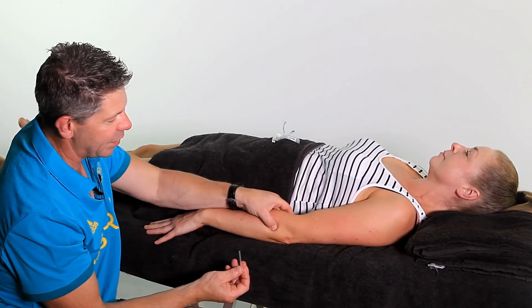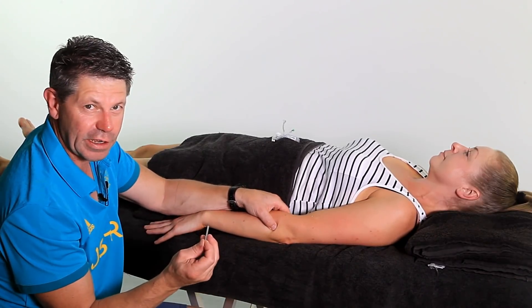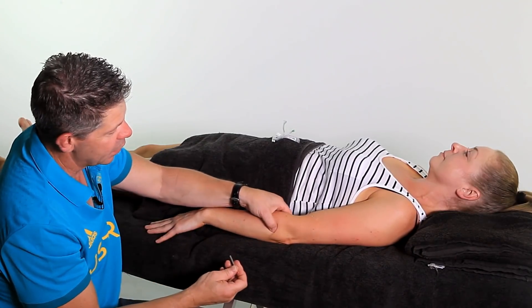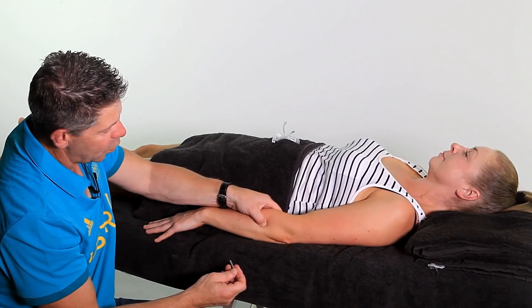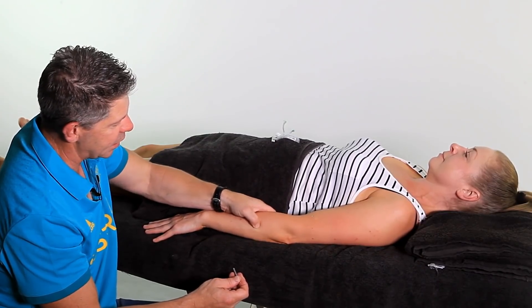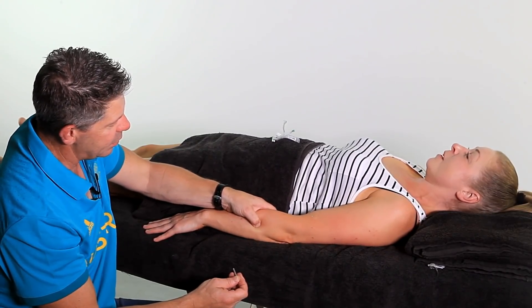Effective dry needling is all about finding the trigger points and needling those — it's not just about putting them anywhere. With extensor carpi ulnaris, you'll find that the trigger point is sort of a mid-third of the way down from the elbow. Check if that's tender through there.